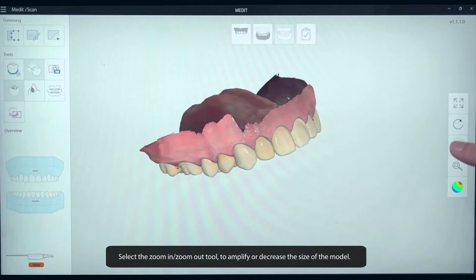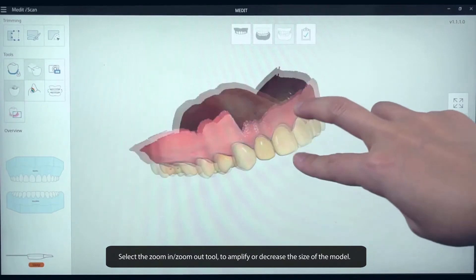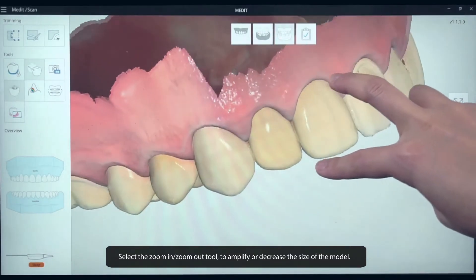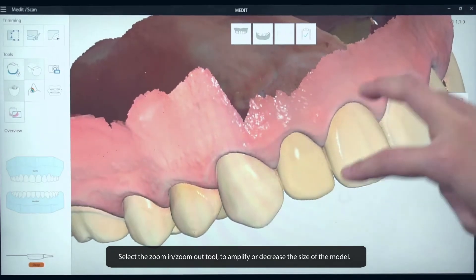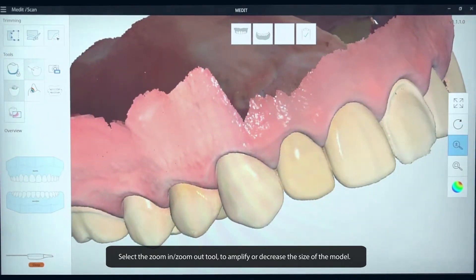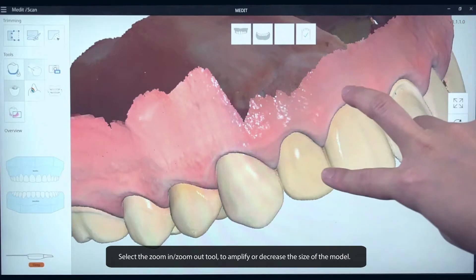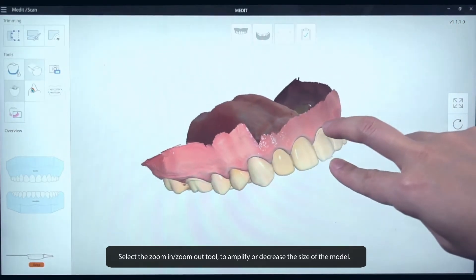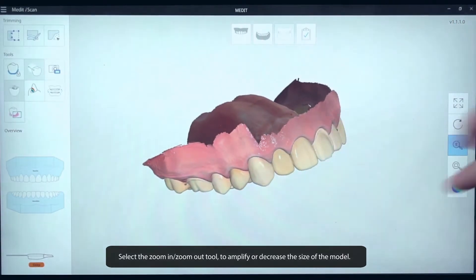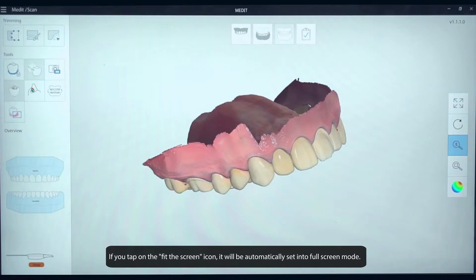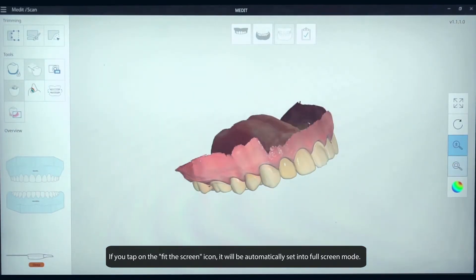Select the Zoom In and Zoom Out tool to amplify or decrease the size of the model. If you tap on the Fit to Screen icon, it will be automatically set into full-screen mode.